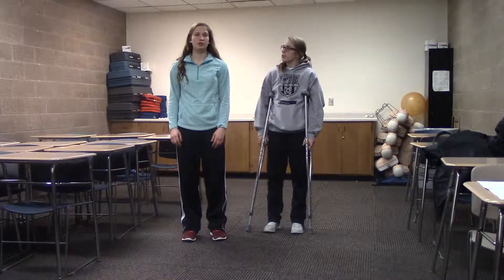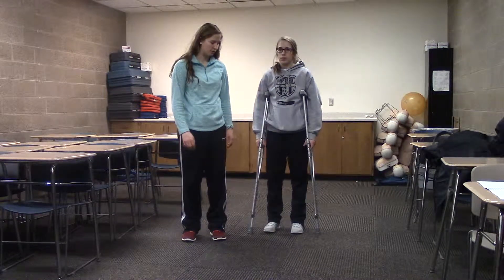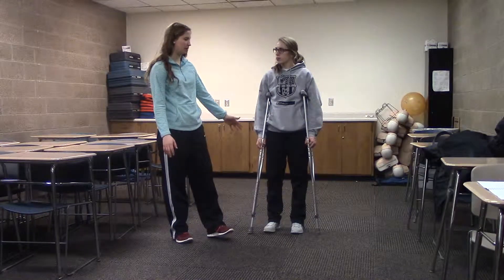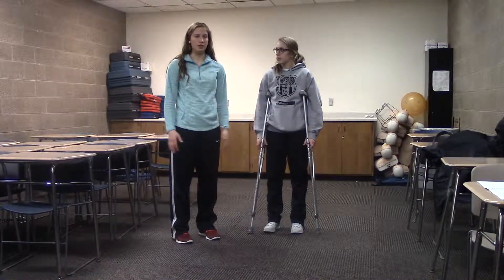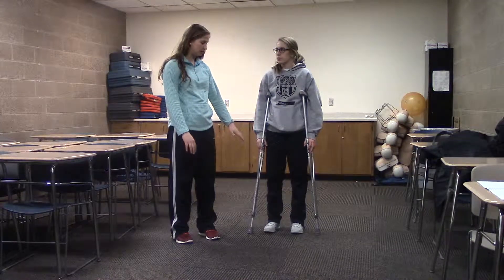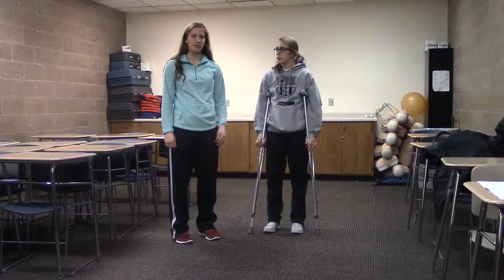Hi, I'm Shania Morse and we're going to do the four point gait crutch method on the crutches. First, we're going to make sure the crutches are fit properly to the person using the different methods and steps for that, and then double check that they're wearing comfortable shoes to keep them safe.